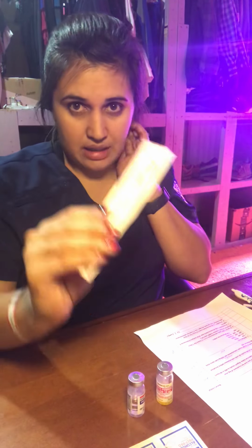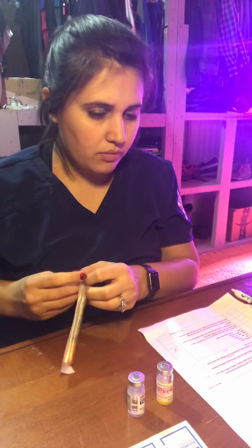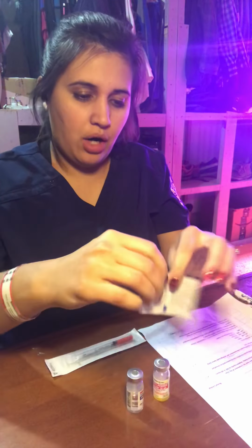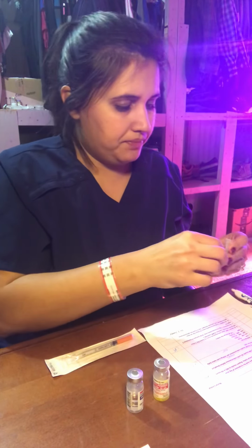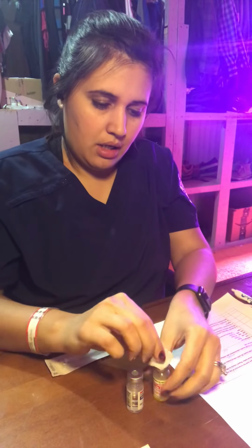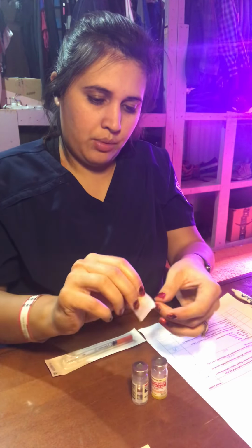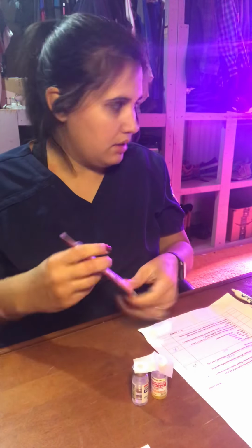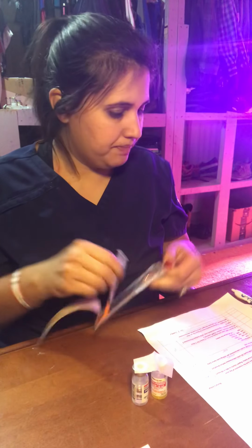I have my insulin syringe. I will now alcohol swab the pads. Quick swipe. Put it on top so I know that I did it. I am going to open up my insulin syringe.